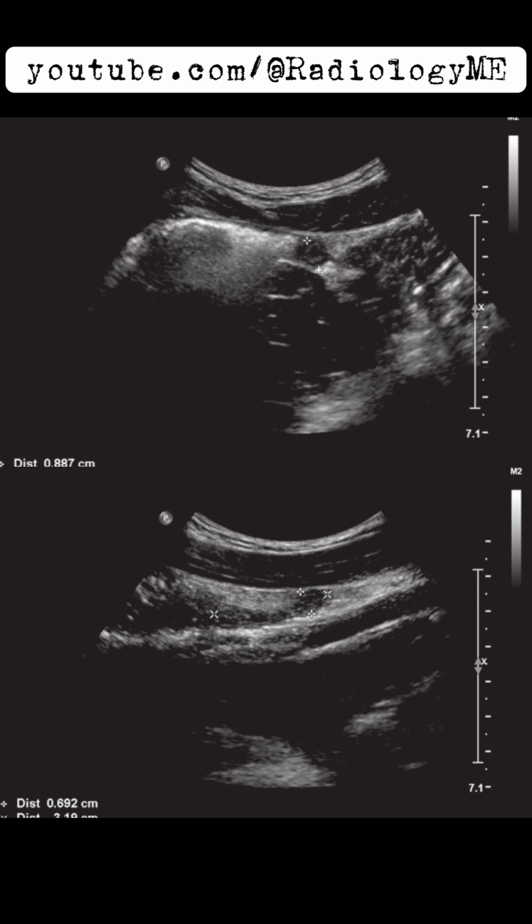What we see here is an ultrasound scan using a curvilinear probe, displaying a tubular, blind-ending structure approximately 9 millimeters in diameter, surrounded by high echogenicity fat, positioned about 2 centimeters below the skin surface. This is an important first finding, suggesting the location of the appendix. Of course, with ultrasound, being aware of the exact region being imaged is crucial for accurate diagnosis.